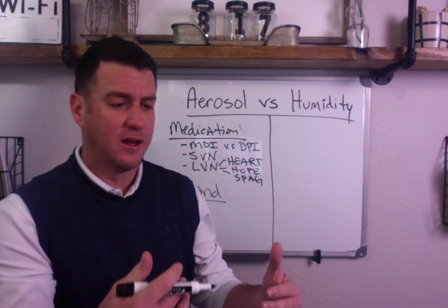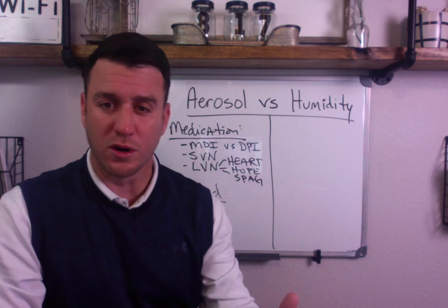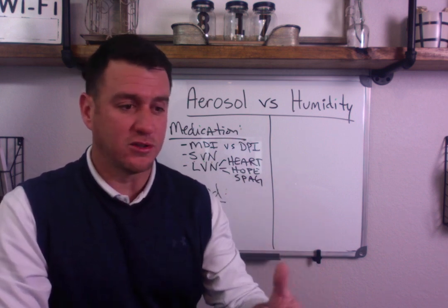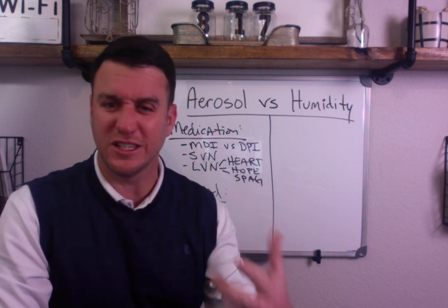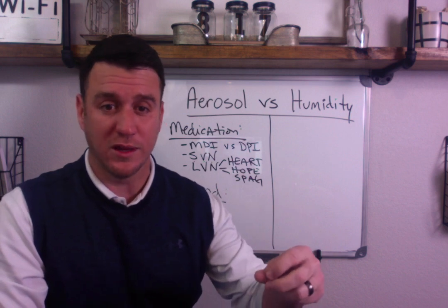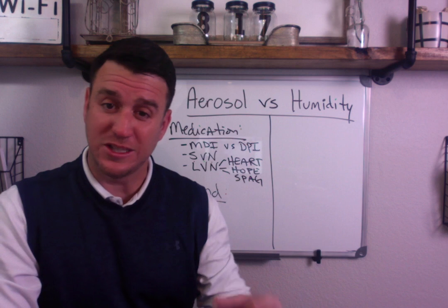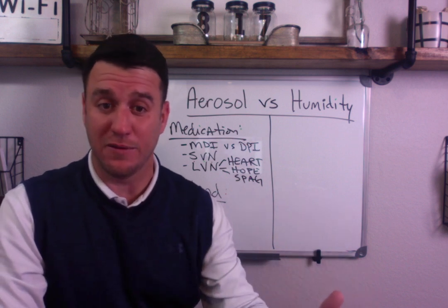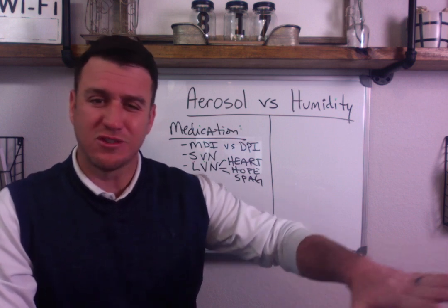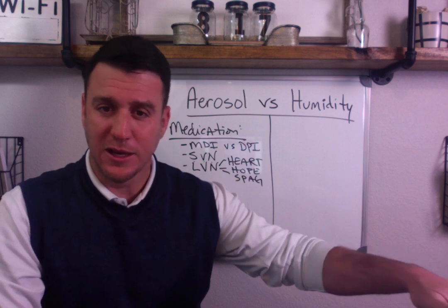Okay, now lots of problems happened with continuous delivery of ribavirin: healthcare worker complications and hazards of exposure. Also, the drug is very sticky, so it impairs the valves associated with the Spag, and if you're delivering this through a ventilator, then you have to watch the stickiness of your expiratory valve while on mechanical ventilation. That's the Spag. It's old. Just remember, Spag goes with ribavirin and RSV, and you'll be good.